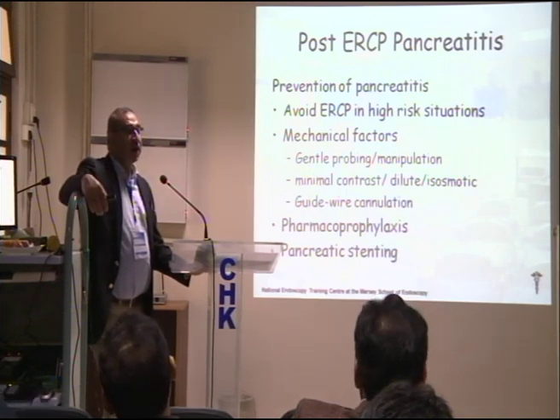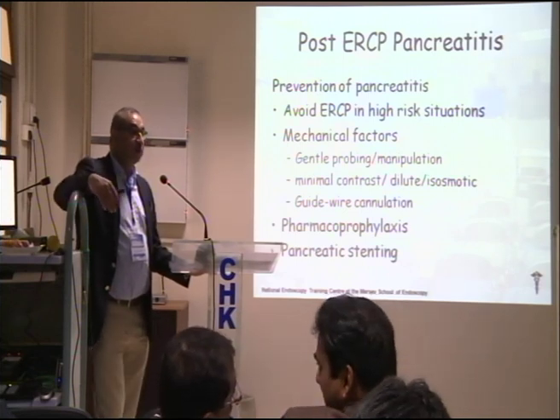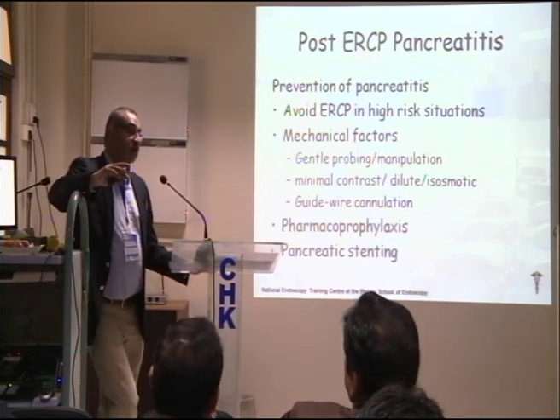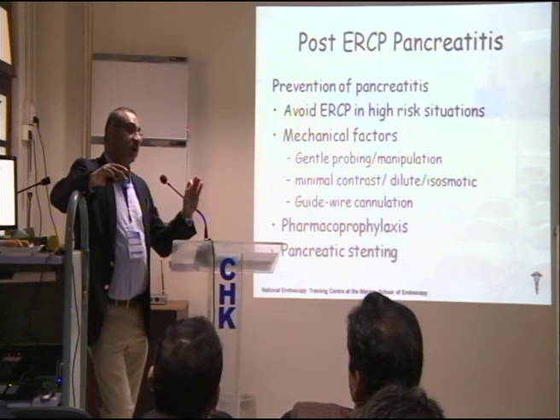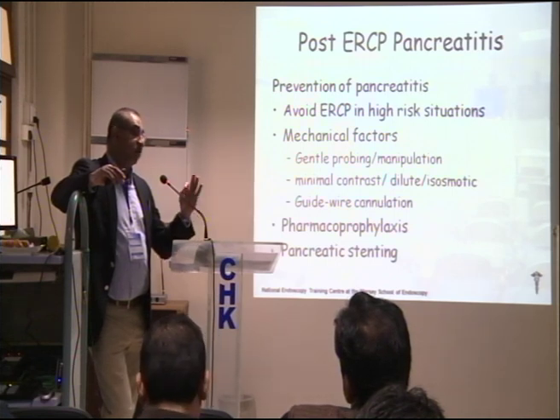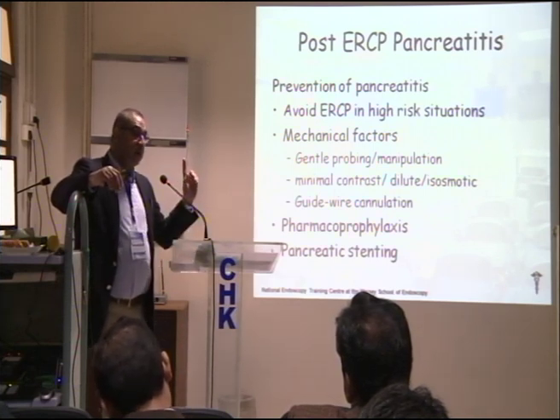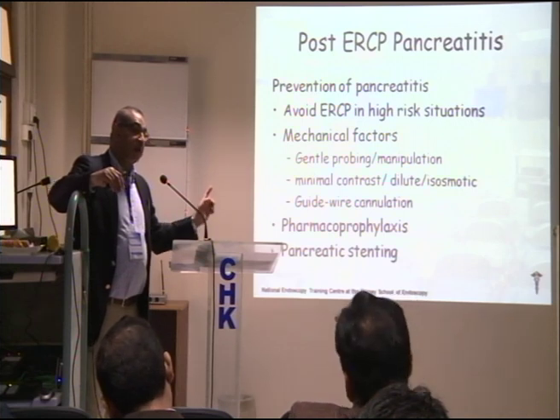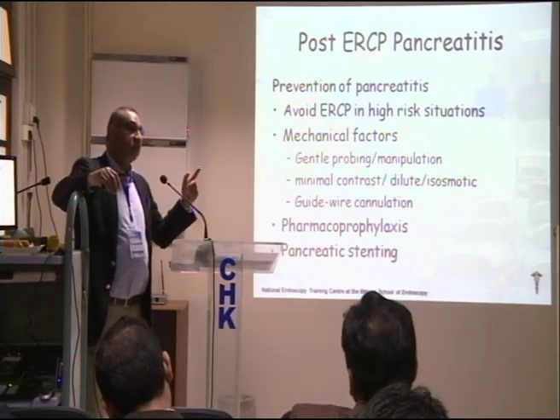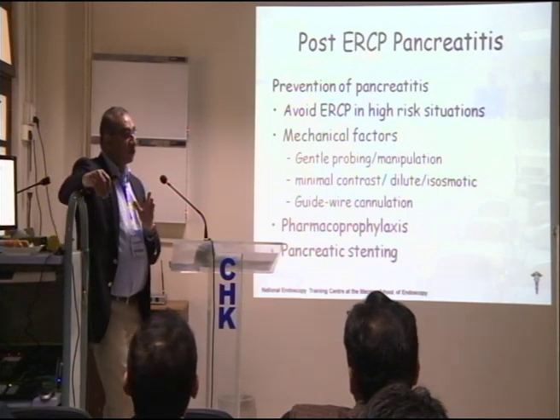I think it's very difficult to answer that, because what I normally do in my own practice, if I find that it has had quite a bit of prodding, then I would put a stent in. Even if I've got in several times and it's a very gentle cannulation or gentle wire, I wouldn't bother. Because when you are doing a pancreatic duct stent or a pancreatic duct sphincterotomy, you are adding on another procedure with complication. So always be careful of that.